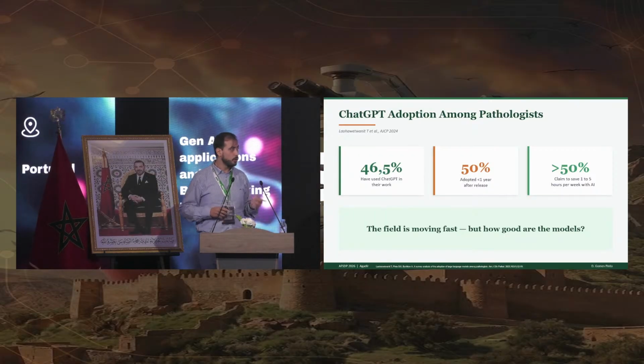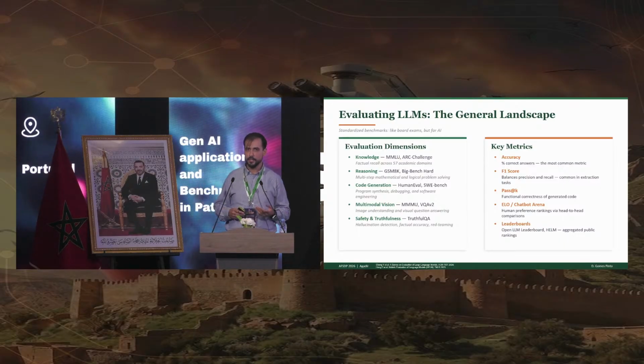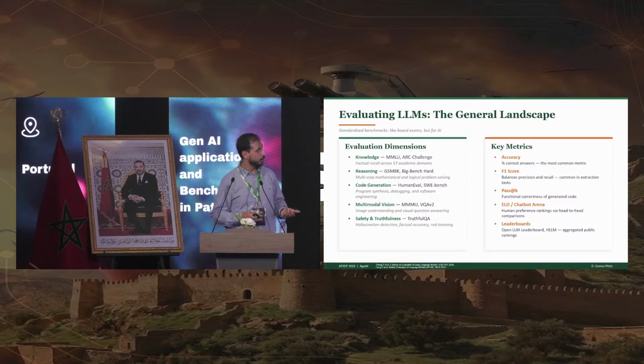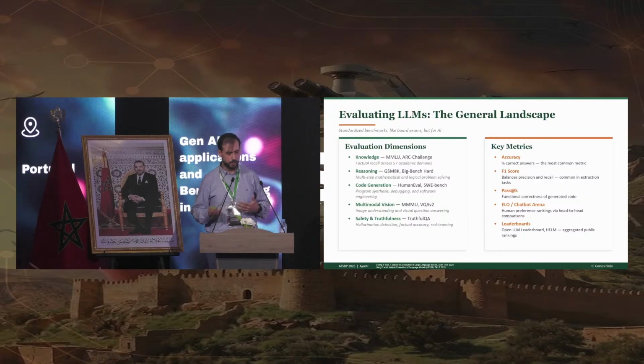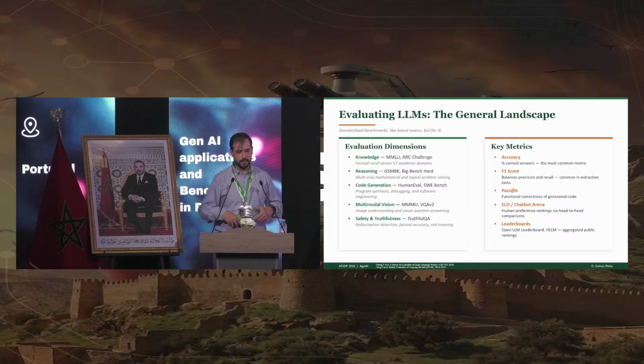But do we know how good they are? And the answer is maybe not really. In the general domain, this is a problem of benchmarking, and that's why we're talking about benchmarking. And this has developed further along than what it has in pathology. And we can evaluate the models in several domains. There are several well-known benchmarks with known performances. New models, when they come out, you might have read some of these names. When they come out, they are tested on these benchmarks, and the companies use the metrics as publicity.